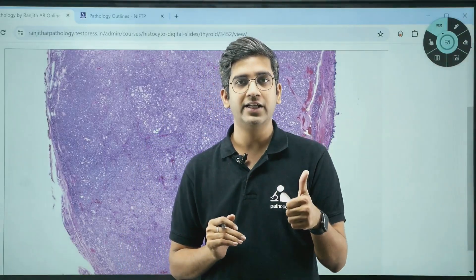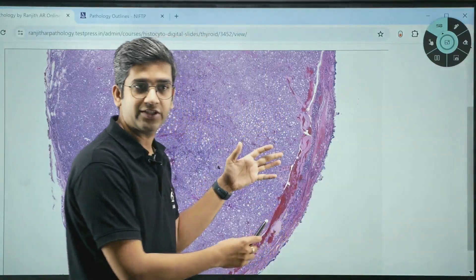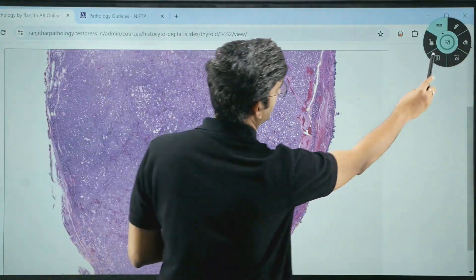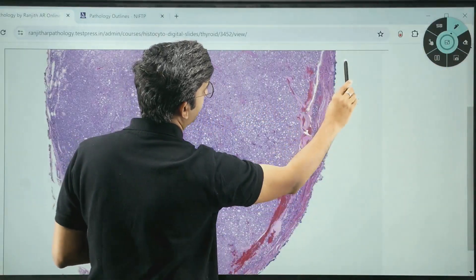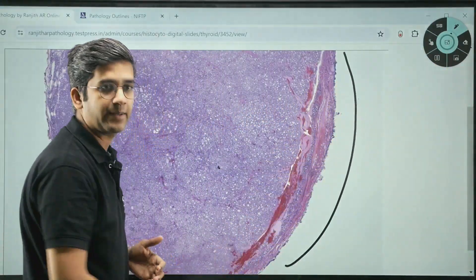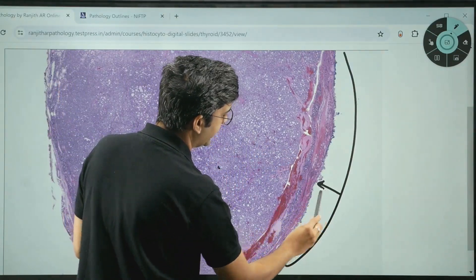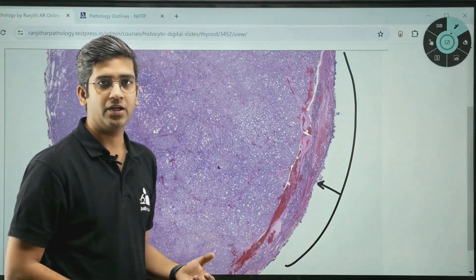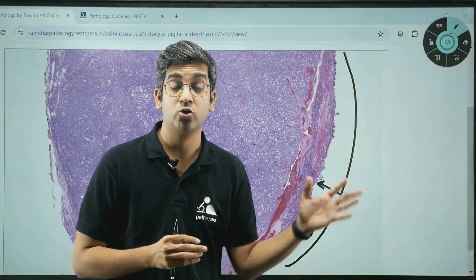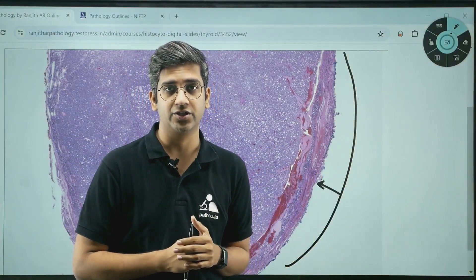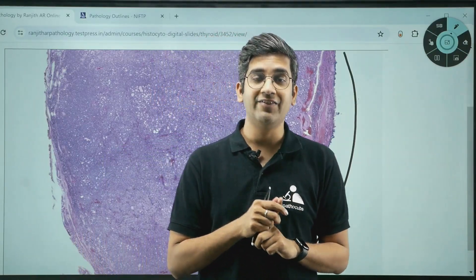The first criteria: it has to be non-invasive and it has to be encapsulated. If you look at the slide — it is a digital slide from the digital archives of pathology — you can see a perfectly normal encapsulated structure. This is a very low-power image with almost nil invasion. All the things on the sides are normal thyroid gland. It is not an invasive structure. It should be an encapsulated lesion — it should not have invasion.